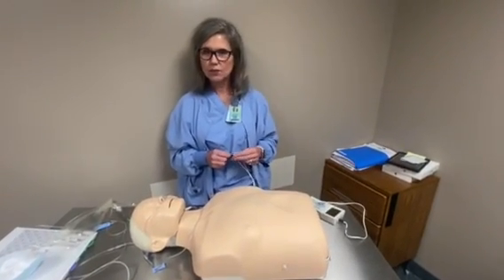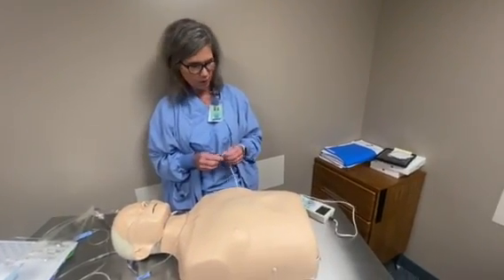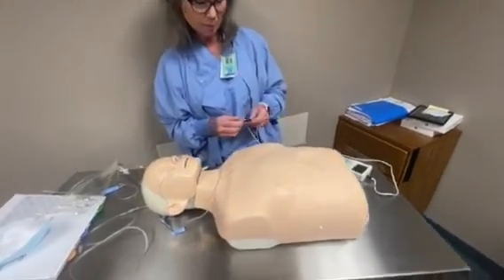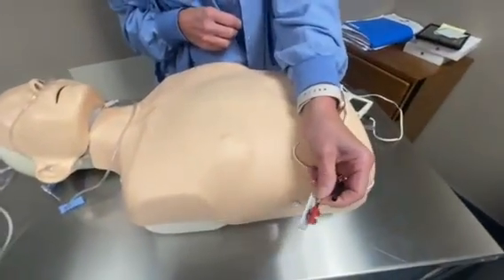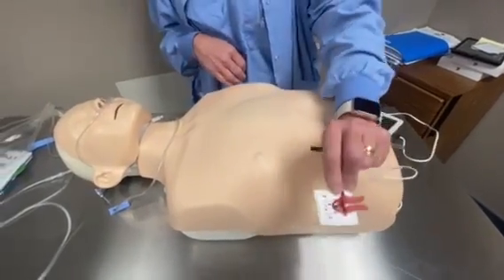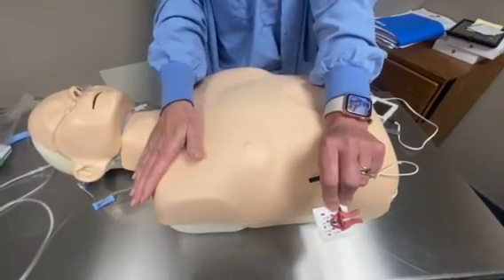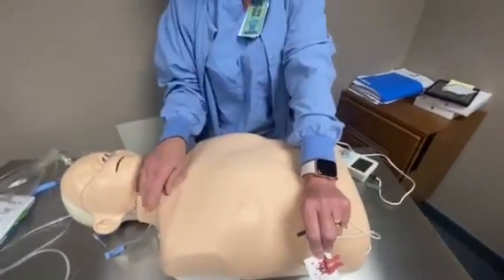If your doctor chooses to use a nerve stimulator — some of them do, some of them don't — consult your book to inform yourself on whether they want to use it. If you do, it's very simple: you put your EKG lead on there and then put it anywhere on the extremity. I've been told you could even put it on the opposite side, but I like to put it on the same extremity. So say they're doing an interscalene block — you put it down on the forearm.